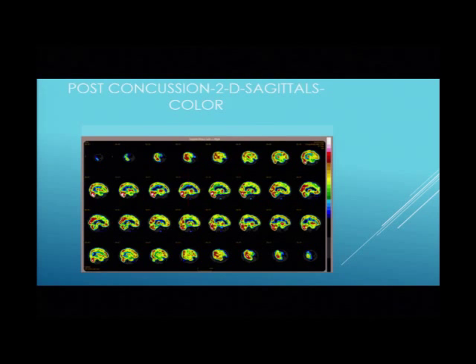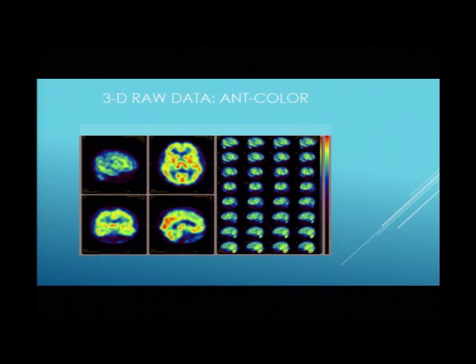Those V-shaped areas are very classical of a vascular injury. So now we go to 3D, and we have several different 3D now on these wonderful new pictures. This is the 3D of what we call the raw data. This takes the data that we just looked at and just records it on the surface. And instead of having 16 views, it takes 2 pages. There's 4 times 8, there's 32, there's 64. That's because it's so sensitive and so accurate.